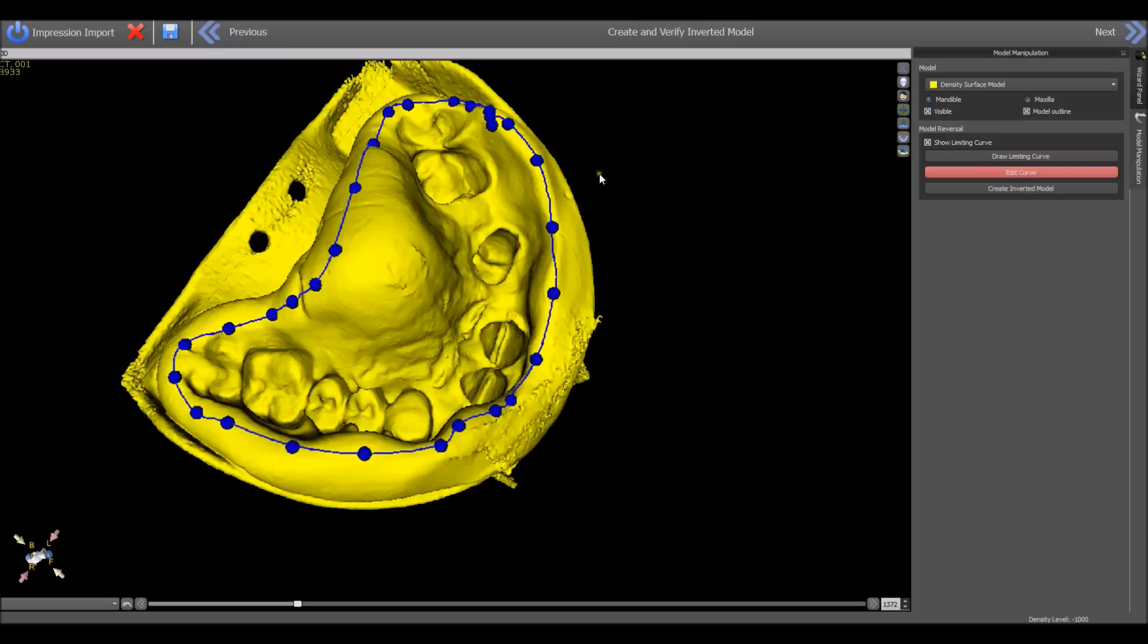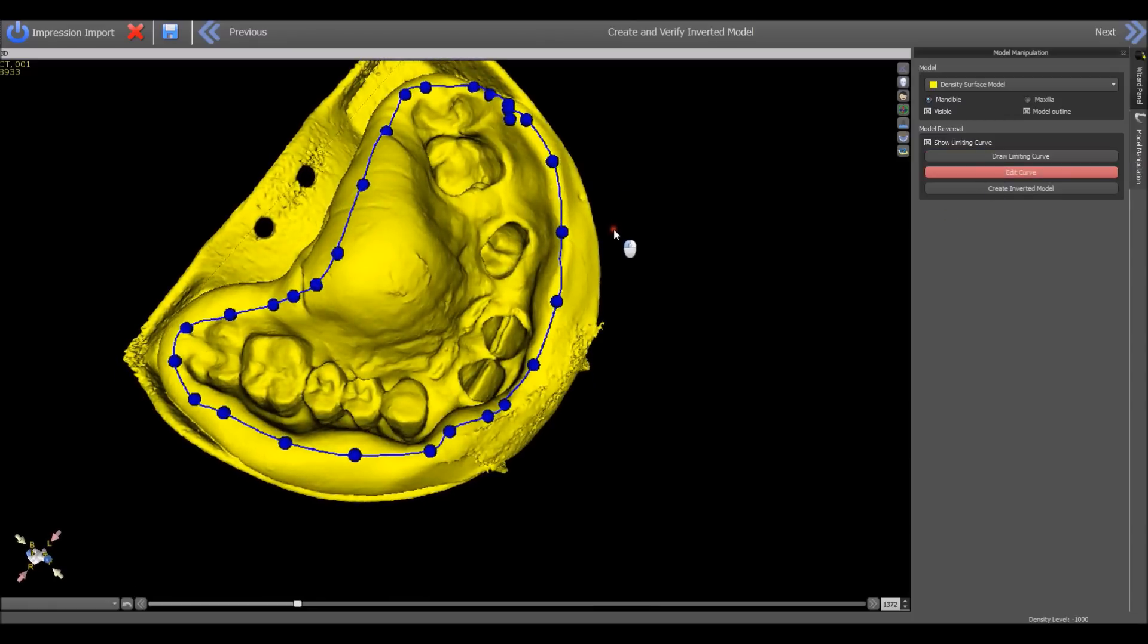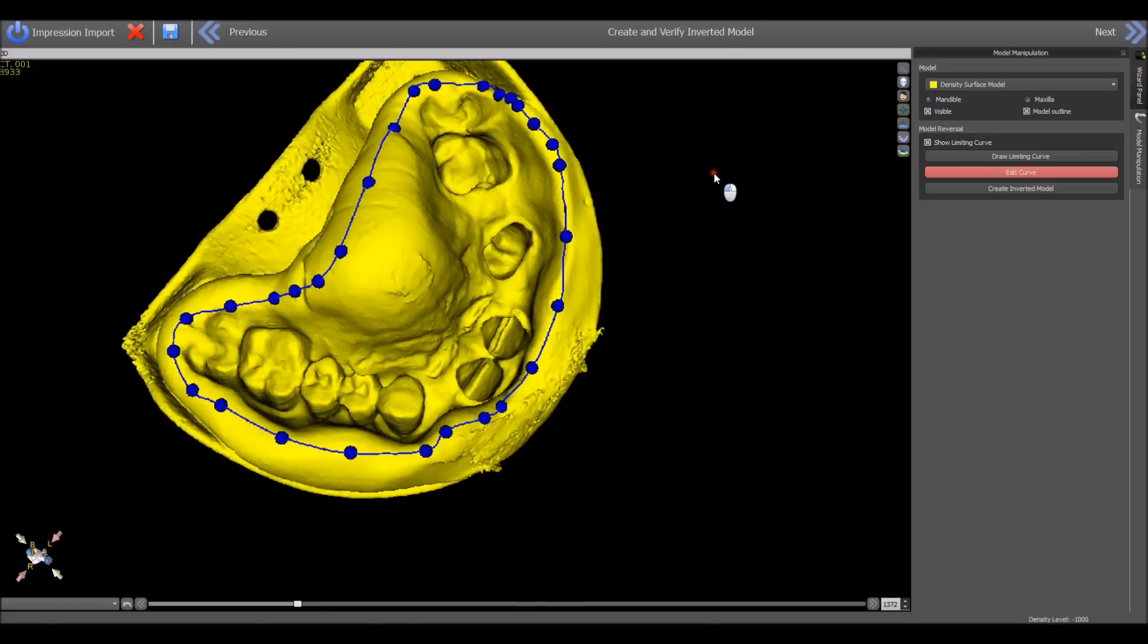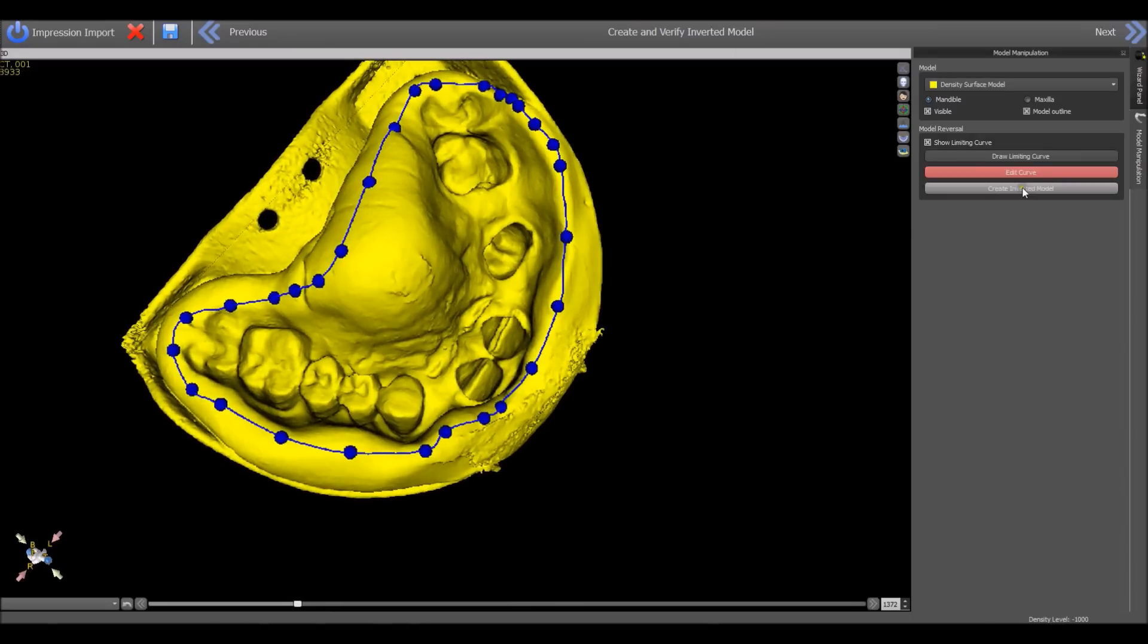Now you have the opportunity to fine-tune the placements. And once you're happy with the placement of the curve, create inverted model.